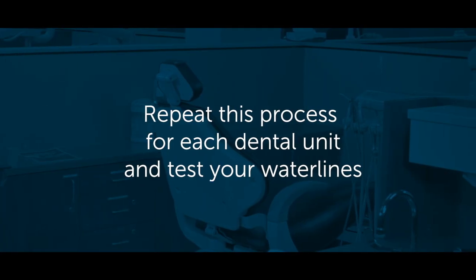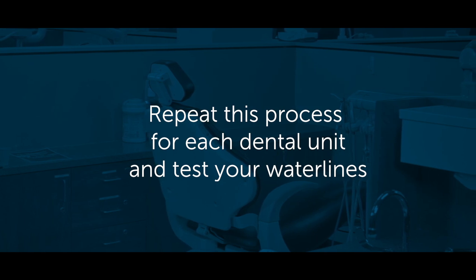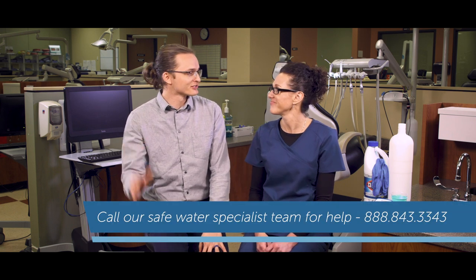Good work — you have successfully shocked your unit's water lines. Now repeat this process for each dental unit and test your water lines to make sure your protocol was effective. Practices who shock, treat, and test consistently have the safest water lines. If you have any questions about shocking at your office or developing an effective treatment protocol, just give our team a call — and feel good, you just invested in your patient's safety.